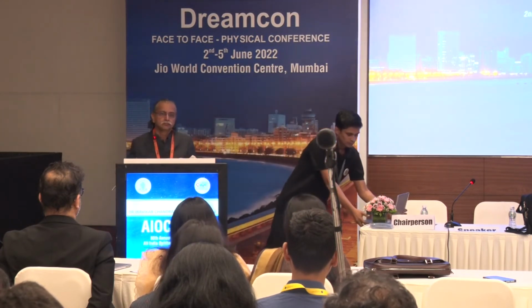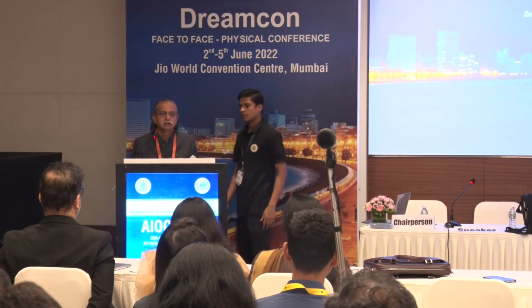And suppose you land up with a rent during your nucleus management. So what would you do? Do you go ahead with the phaco, or, let's say if it's a hard cataract, and you have a significant amount of nuclear fragments still lying there? Yeah, that becomes a very, very difficult situation. What I will do is, first of all, I will not withdraw the phaco probe immediately.